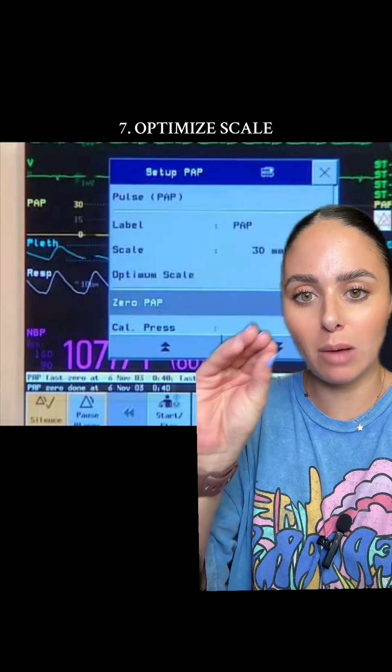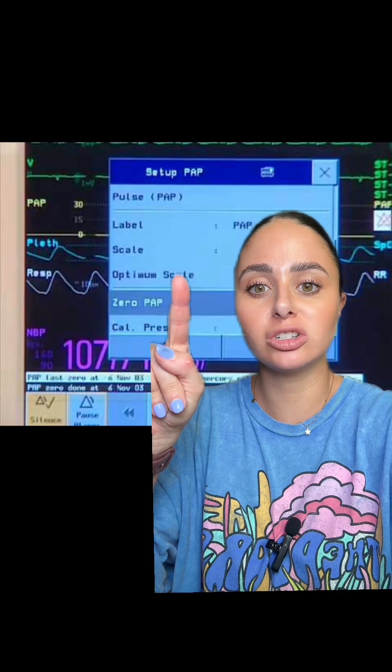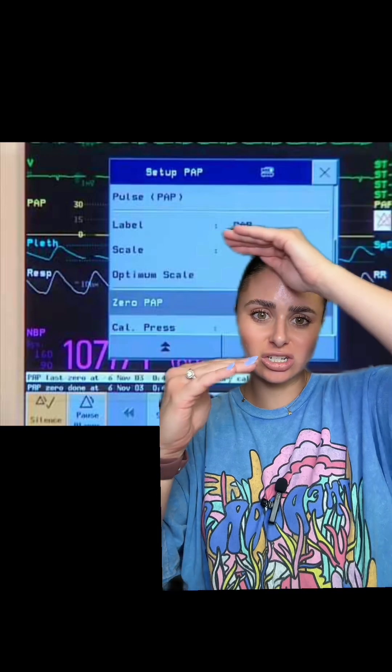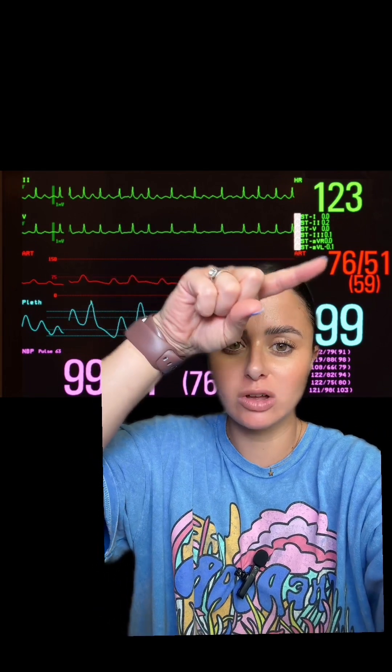The next thing I would do is optimize your scale. Every monitor is a little bit different, but somewhere on your monitor there should be an option to optimize your scale, which changes the range of what your blood pressure is measured in. For example, if your scale is measuring between zero and 150 and your blood pressure is 76 over 51, the waveform looks tiny and can appear over damped. If you optimize your scale to a range of 30 to 90, the waveform is going to look a lot better.